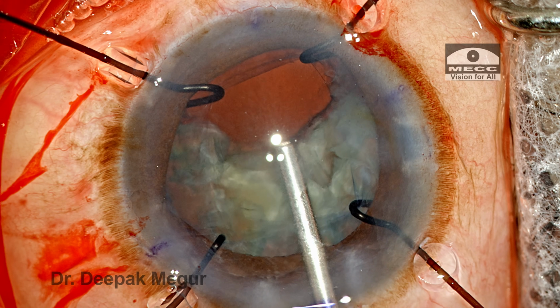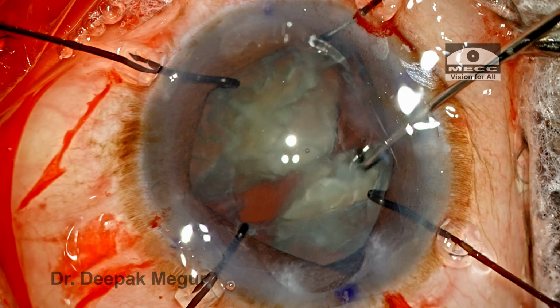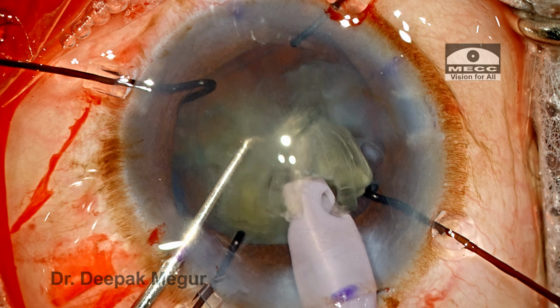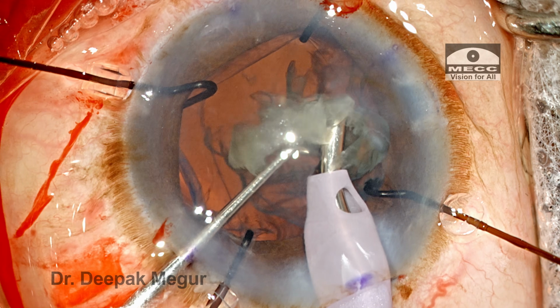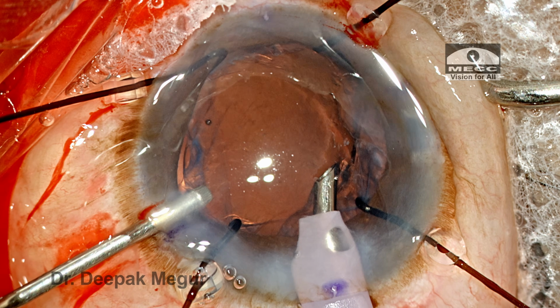See, as soon as the capsular bag is stabilized, you realize that doing surgery seems almost like normal. In such situations where there is significant zonular weakness, I would think that it is worthwhile to go in and hook the capsular bag. It makes the surgery safer and also more efficient.